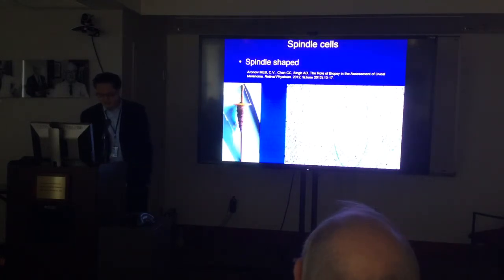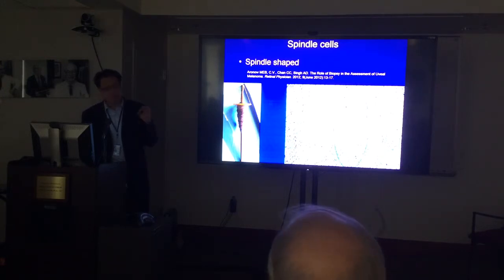On the left is a traditional spindle. A spindle is a tool traditionally made from wood, which is used to spin wool or cotton into yarn. And with the eye of faith, if you look at this patch over here, you can see that these cells appear to mirror the spindle, and they appear to be long, slender, and spindle-shaped. But the important thing is that we can't find any obvious dark stripes of a spindle A morphology or the prominent nucleoli of a spindle B morphology.